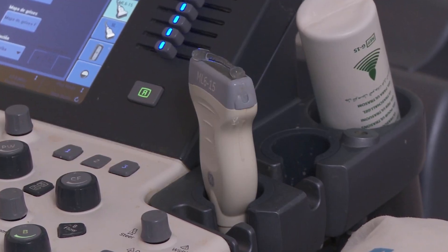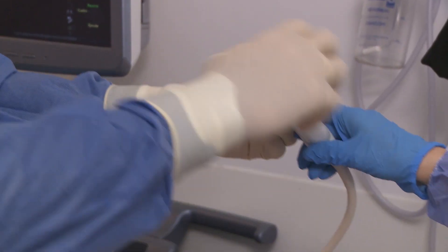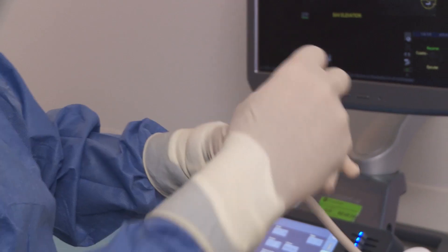The ultrasound probe is impregnated with US gel and covered to create an efficient interface between the probe and the skin.